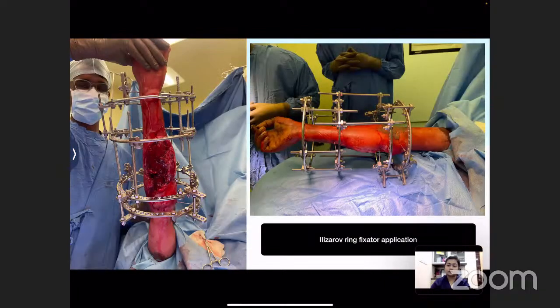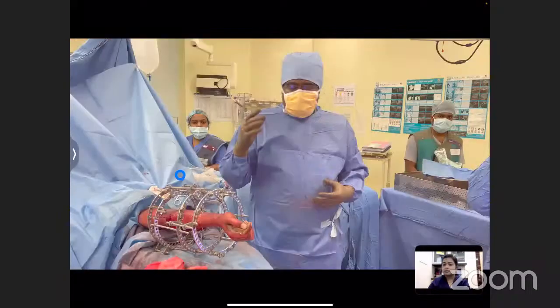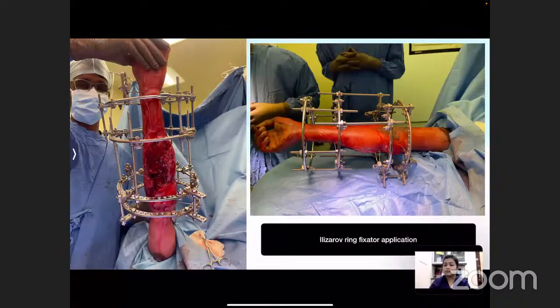Sorry. Here, you can see that I applied a large frame because there are two things. One is I want to put a vac. That's why I didn't put any rod there. So I left a space for the vac application. And also in future, if there is any compartment syndrome, I need to go and do the fasciotomy. So if I put the small rings, I may not be having the space to perform.